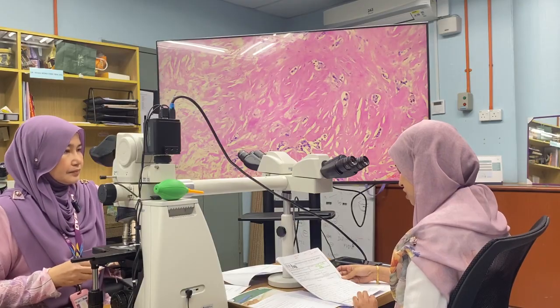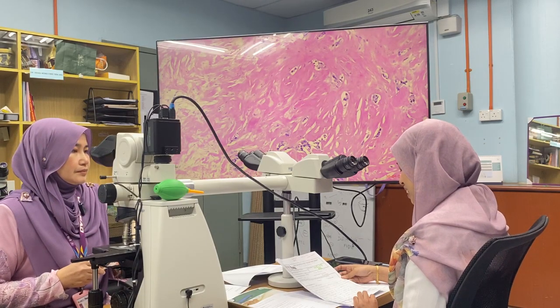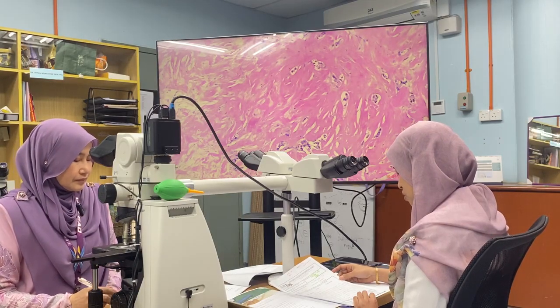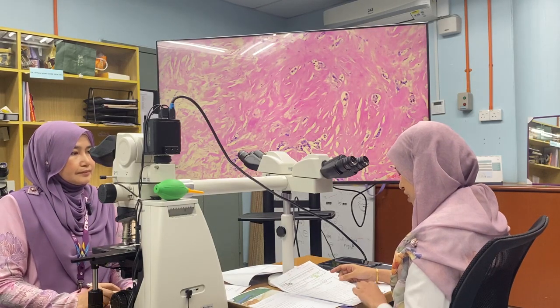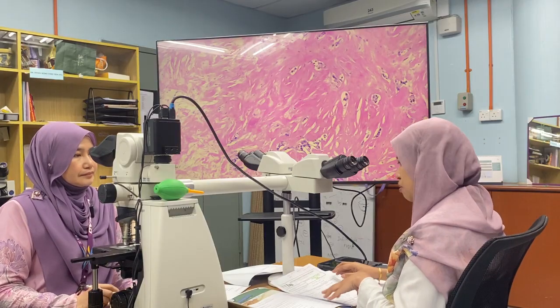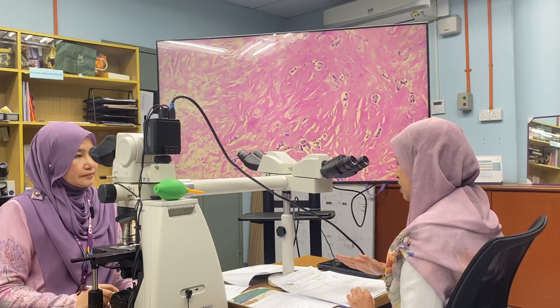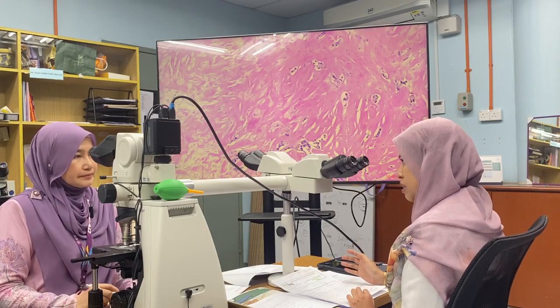There is a well-healed scar on the inner upper quadrant measuring 20 x 10 mm. The deep margin of the tissue is composed of fatty tissue with one foci of muscle, and upon palpation there is a firm to hard mass on the upper outer quadrant, which correlates with the radiological imaging of the previous tumor size.